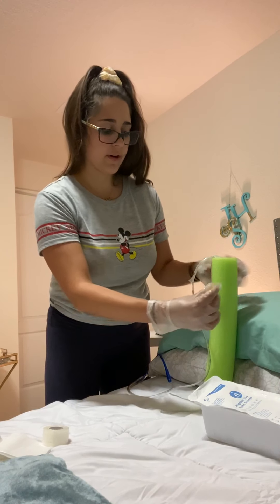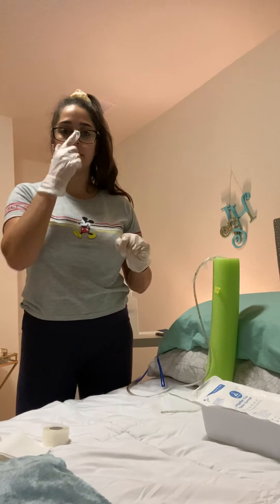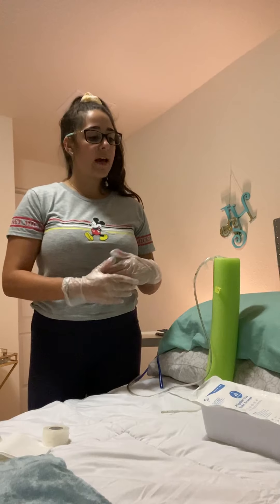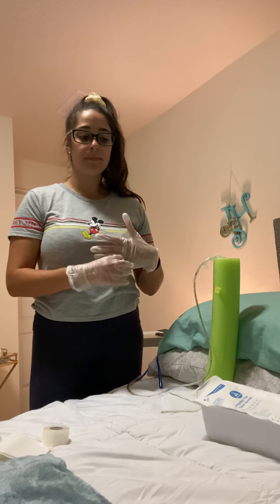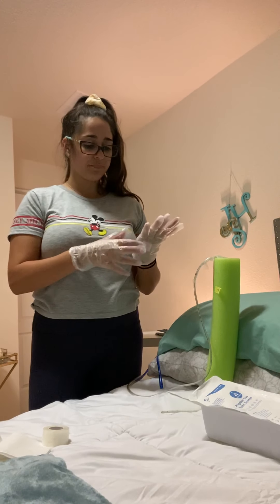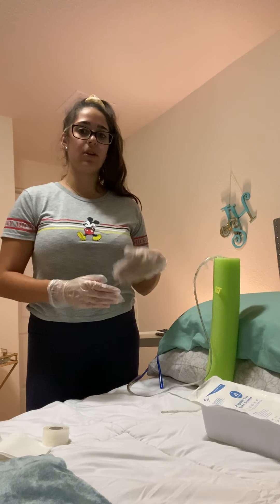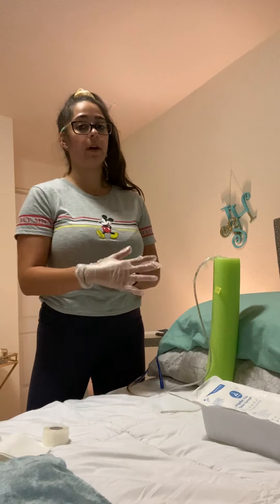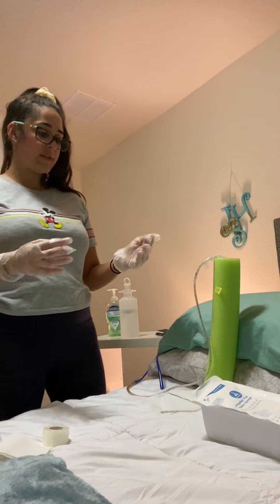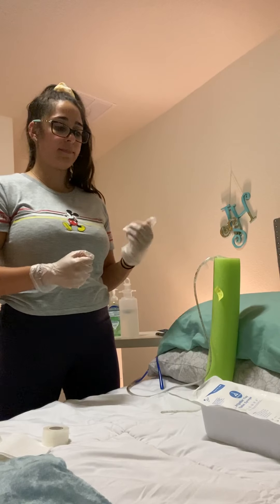I'm now going to perform hand hygiene and put on a new set of gloves. I'm going to perform oral care for my patient — brush their teeth — and with a warm towel and some soap, wash their nostrils. I'll also note that before inserting the tube, I made sure they were in a high Fowler's position. Now I'll make sure they're in a comfortable position, with the call light within reach, side rails raised, and bed lowered.